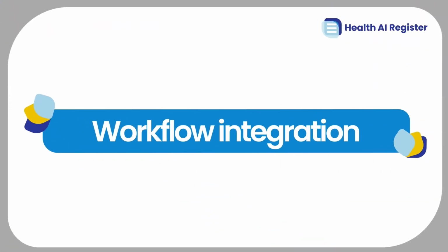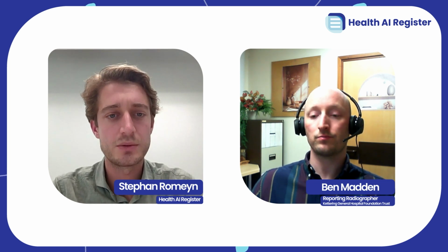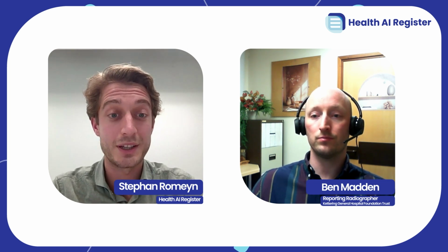And if we talk about the integration into the workflow, what we normally hear is that it can be quite challenging to do the data orchestration, to really make sure only the potential fracture cases will be forwarded to the algorithm. How do you do that in your clinical practice? Yeah, it can be tricky when you're initially setting up, because you don't really foresee a lot of these issues. It all depends whether you're sending from the X-ray modality itself, or whether you're initiated by some sort of PACS button.